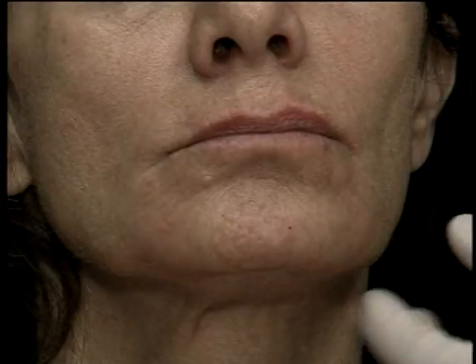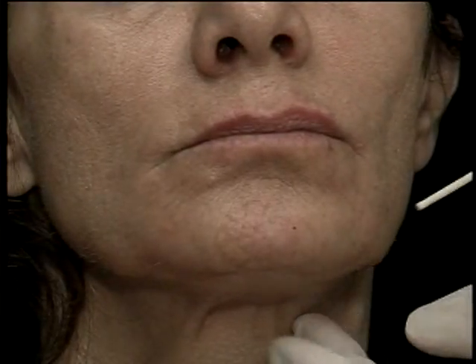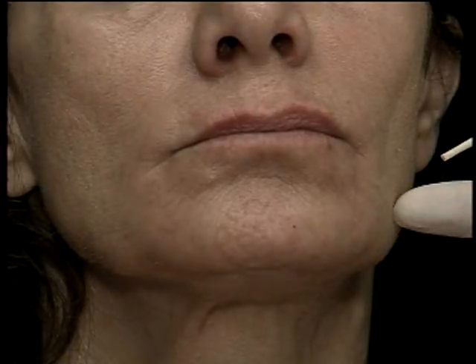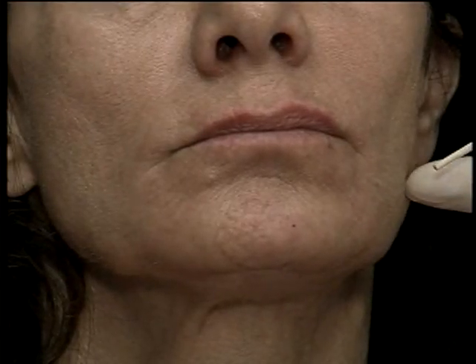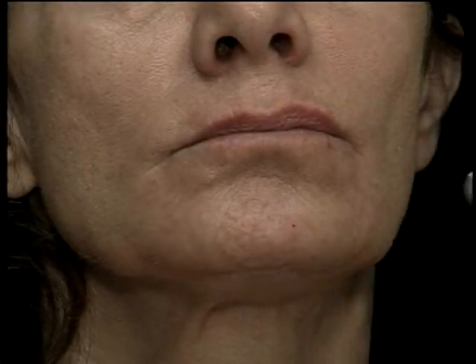especially for someone who has significant jowling and they want to have that appearance of a nice streamlined jaw. By placing a little bit in there, it gives the appearance that you've lifted the jaw, or lifted the jowl, even though you haven't really done that. But by filling this area in, it gives that appearance. So that is another area that I frequently treat.